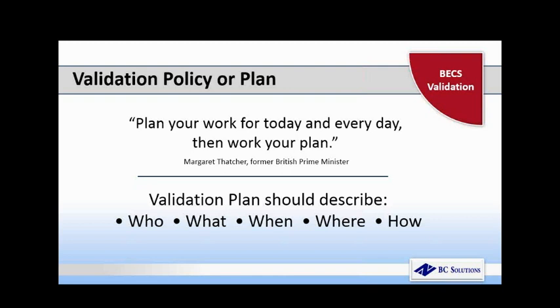So those are items that you can decide for yourself within your facility that's going to meet your needs. So the determinations for when and what validation you're going to do will be done by each facility, and these should be addressed before a need for validation arises, and it should be documented in this validation policy or plan.